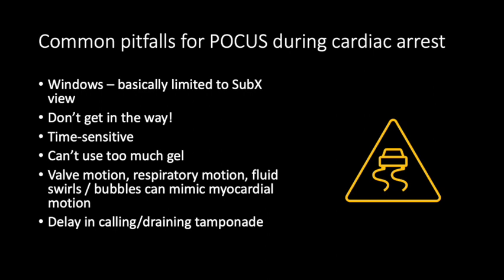The other thing is that sometimes things like valve motion or respiratory motion of the heart itself can cause a mimic effect of what myocardial motion might look like. So someone may actually be in cardiac standstill where we should probably not be proceeding with resuscitative efforts, but really the motion that we're seeing is artifact due to still-moving fluid in the body, respiratory motion, swirls and bubbles from pushing IV meds, and it's not actually due to myocardial contraction itself.